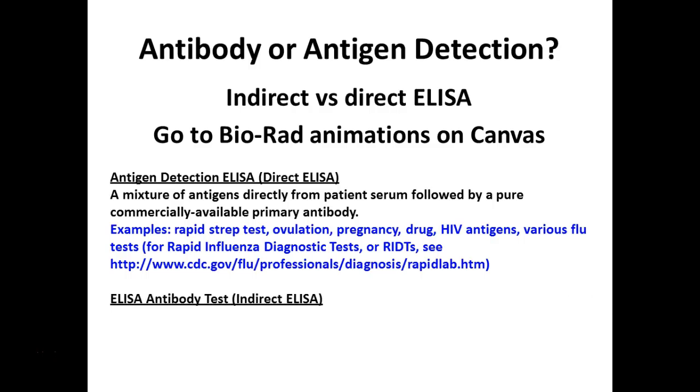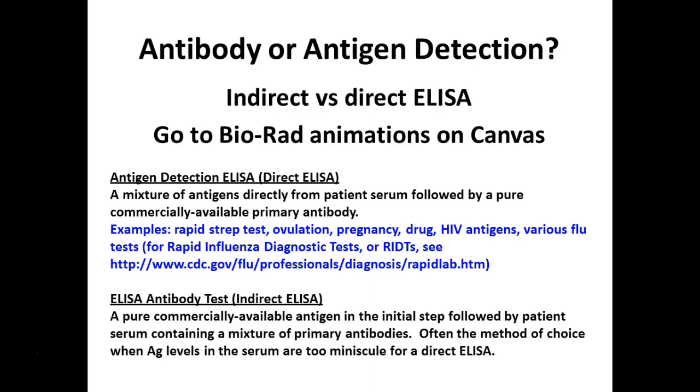So, do we sometimes want to know if you've got an antibody? Yeah. Why would we want to know if you made an antibody? Those of you guys going into nursing school know about this, right? They want your antibody titers to prove you've been what? Vaccinated, right? But we can use it for disease detection as well, right? So again, we're asking the question here, what antibody do you have? So we have to start with a specific antigen, right? A purified antigen, so that your antibody only binds to that antigen, right? And then we put the secondary to be able to detect that primary antibody that's in your sample.